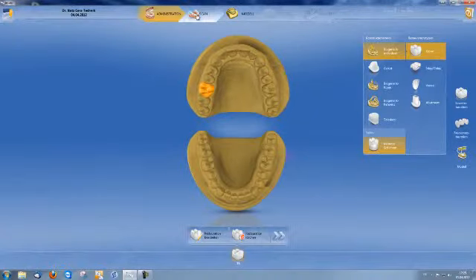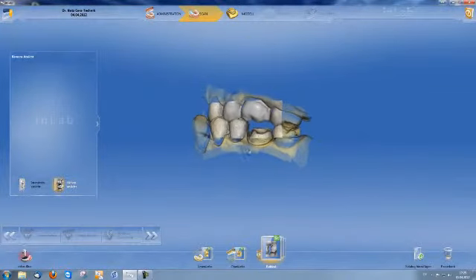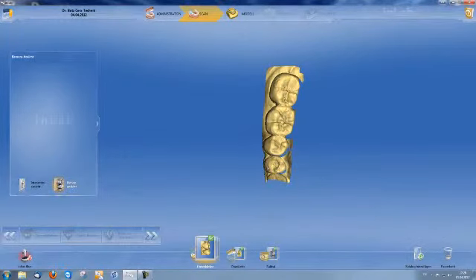In the second step, I switch to scanning. I then have 3 scans: the buccal scan for registration of the preparation and the opposing jaw, the upper jaw as the preparation, and the lower jaw as the opposing jaw. Model calculation is next.